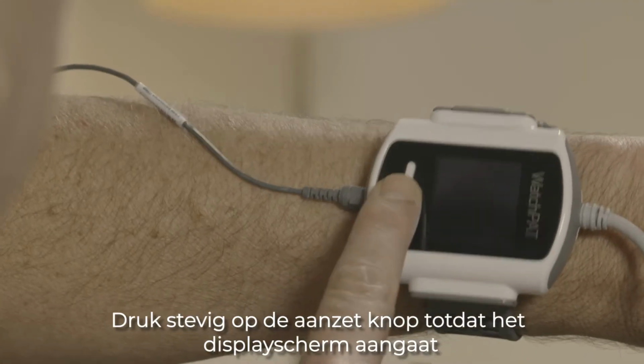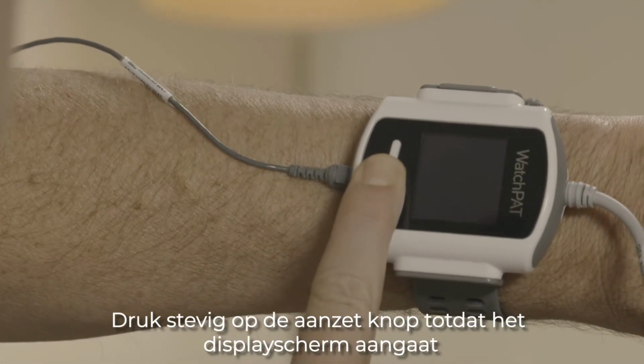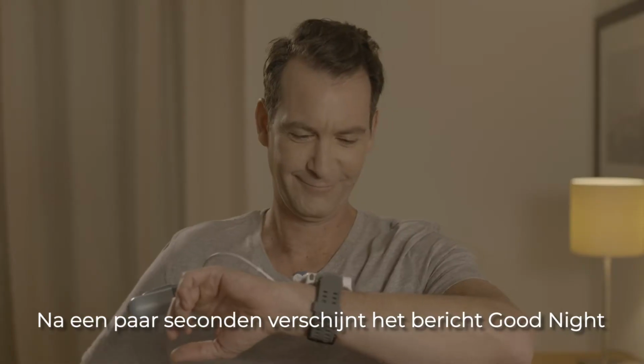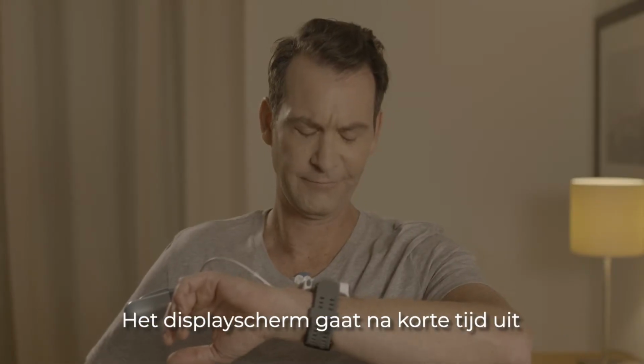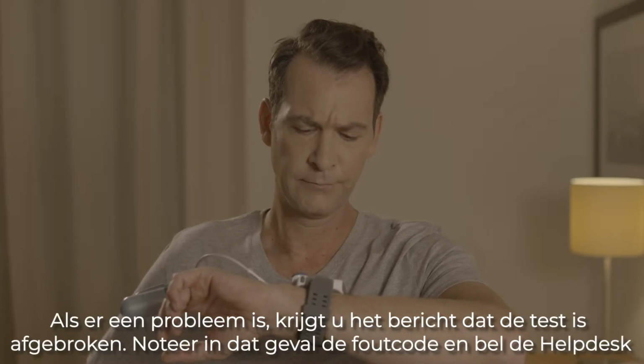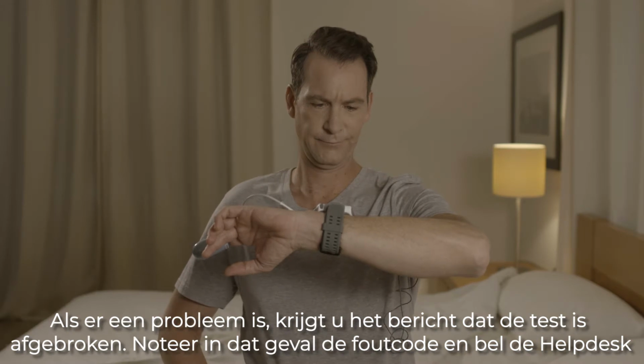Press firmly on the power button until the display lights up. After a few seconds, the good night message will appear. The display will turn off after a short period. If there is a problem, you will see a test aborted message. In that case, note the error code and call the help desk.